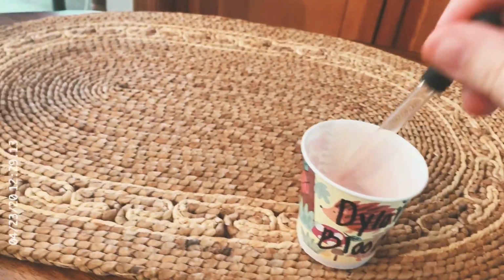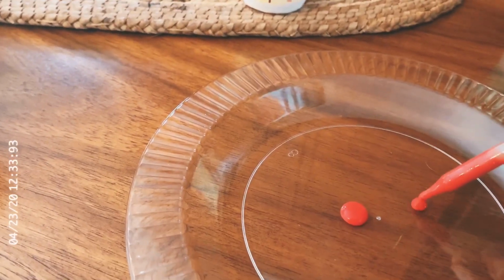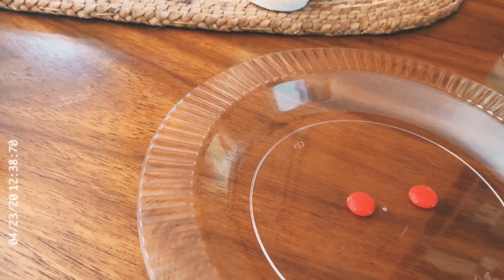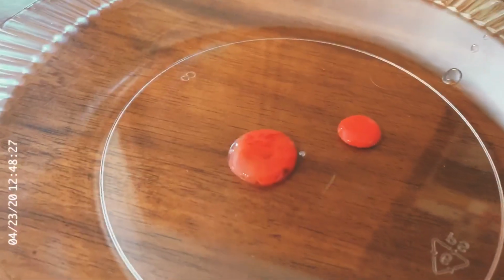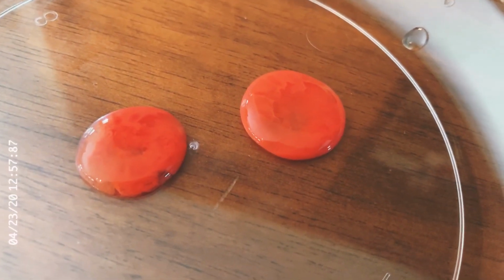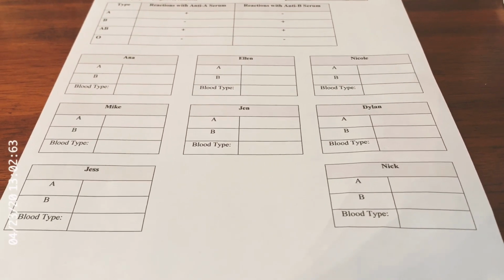Last but certainly not least, we have Dylan. Let's get his sample. Put it on our plate. Clean out my medicine dropper. And we'll do his anti-A first. Okay, go ahead and do his anti-B. We're looking at it, we're writing down our results. All right, you should have a nice filled in lab report with your pluses and your minuses.